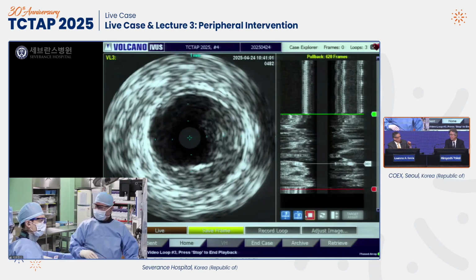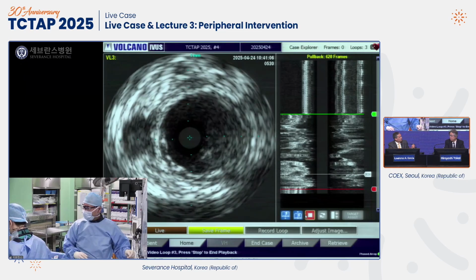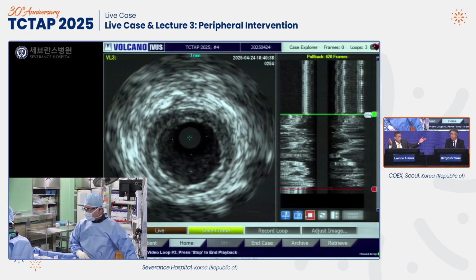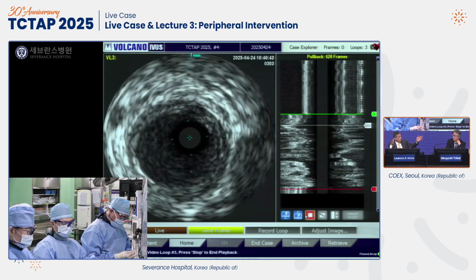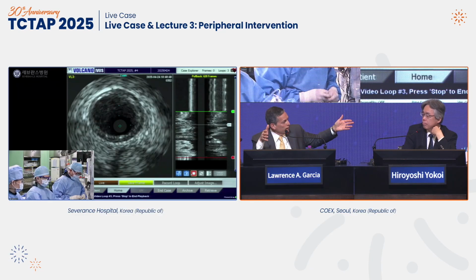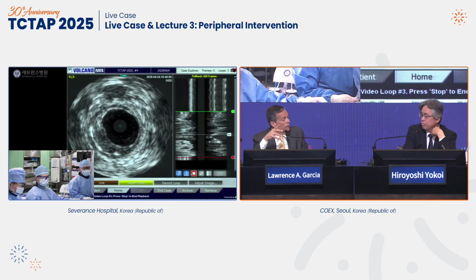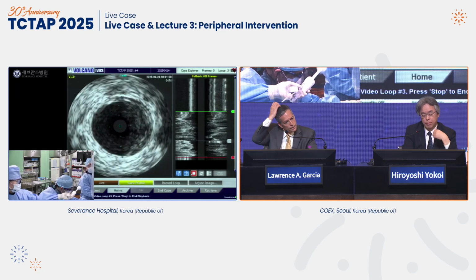I was just going to say, to that point, the Italians, Marco's paper, really showed that, at least in the global impact data, with the long lesions, it was a 40% to 50% stent rate. That was, again, because of lack of predilatation. In their trial, again, 17 or 19 centimeters, I can't remember. Remember, the pivotal trial was 10, but they did predilatation for 4 or 5 minutes, and then they did their DCBs, and their stent rate fell. The pivotal trial was around 4% or 3%. This one was 6%. So I think it does give some validity to going down a DCB route.